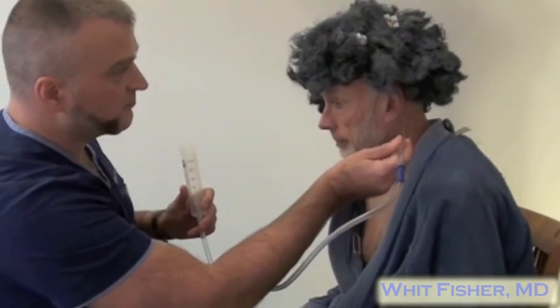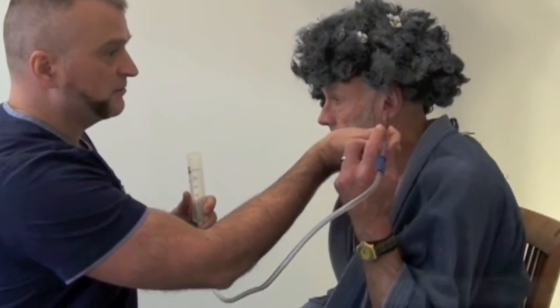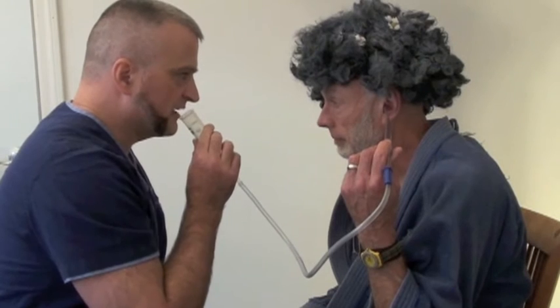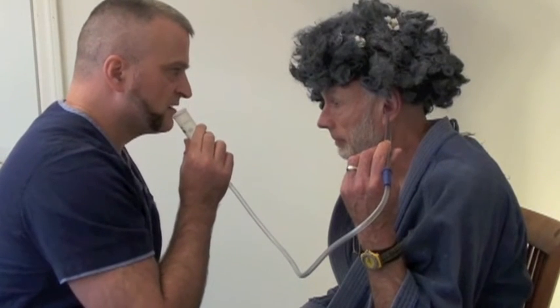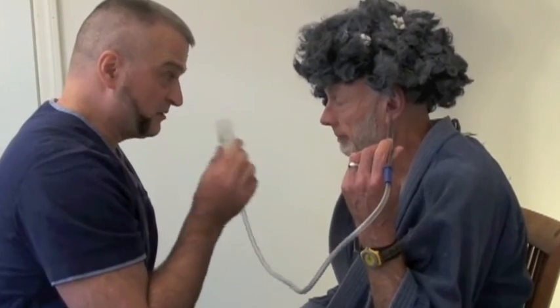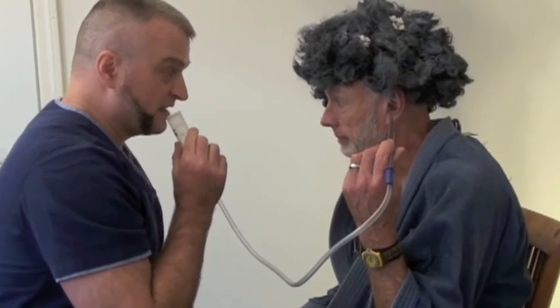Be careful. This gets really loud. Don't hurt anyone. Speak softly at first, and then increase the volume of your own voice until the patient can hear you. This device is super fast to make, incredibly inexpensive, and it really works. Enjoy!